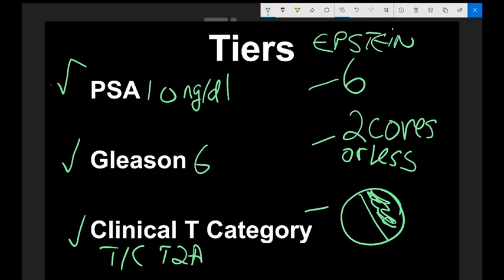Do notice that this patient has already had at least a single biopsy, otherwise you wouldn't have cores to make this designation and this Gleason designation. So this is after a single biopsy has been performed. Now the patient goes into MR surveillance.